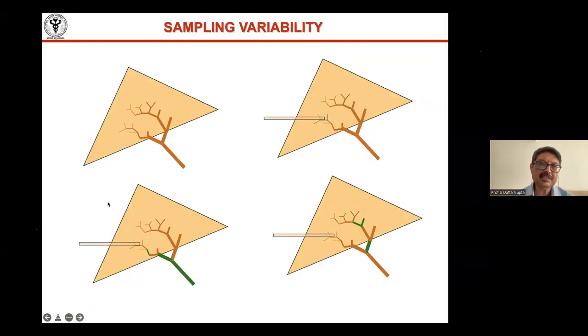And the other thing is, for example, in cases of primary sclerosing cholangitis, this is the biopsy. We do it in the right lobe. Suppose it's a small duct PSC and your needle goes through it. Wonderful. You'll get all the changes that are necessary to make the diagnosis. Now, suppose the larger ducts are affected and the biopsy goes through one area where the smaller ducts are not affected. So you will get the features of a bile duct obstruction on biopsy.